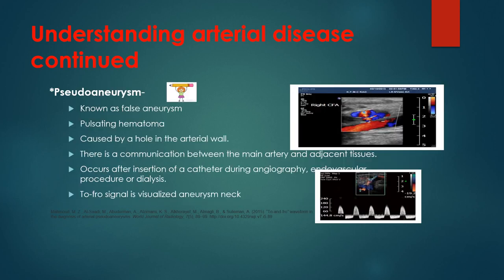A pseudo-aneurysm, also known as a false aneurysm, is a pulsating hematoma caused by a hole in the arterial wall. There is communication between the main artery and adjacent tissues, and it usually occurs after insertion of a catheter during angiography, an endovascular procedure, or dialysis. A to-and-fro signal is visualized in the aneurysm neck — you can see the hole in the wall, blood flowing into the tissues, and the waveform obtained right at the neck of the pseudo-aneurysm.